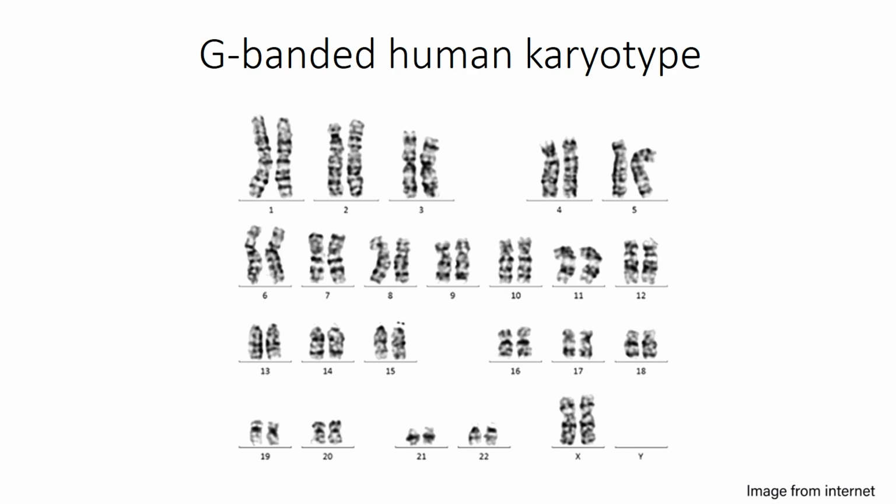Here you can see that there will not be any mistake. You yourself will be able to see that these bands are very constant. The bands present in one chromosome are the same bands present in the other chromosome. You can see the thickness, you can see the bands, everything remains the same. So this way you will not make any mistake, and the chromosomes are paired.